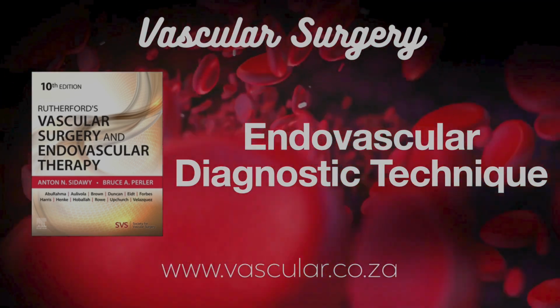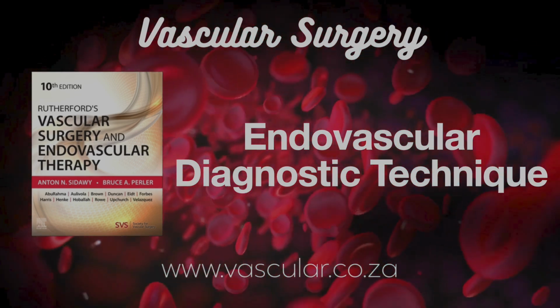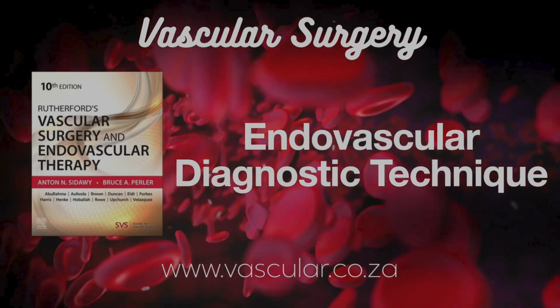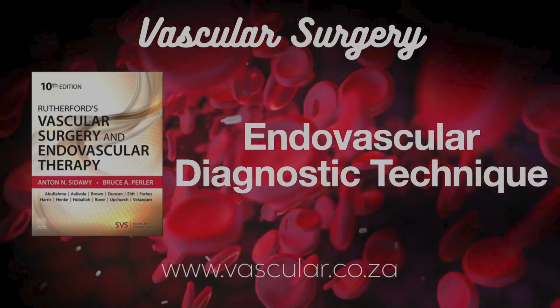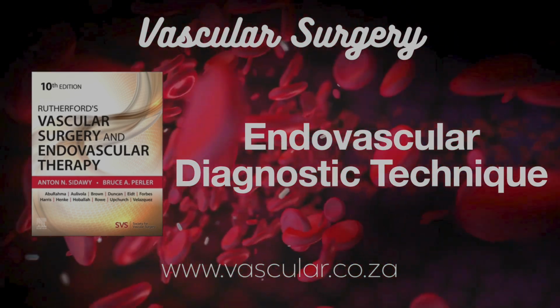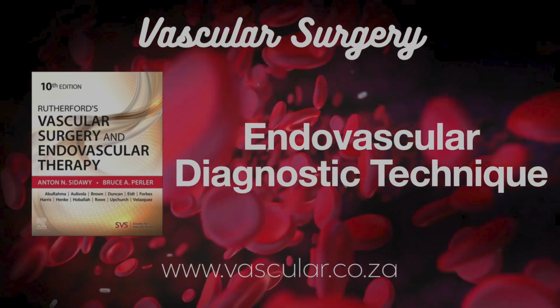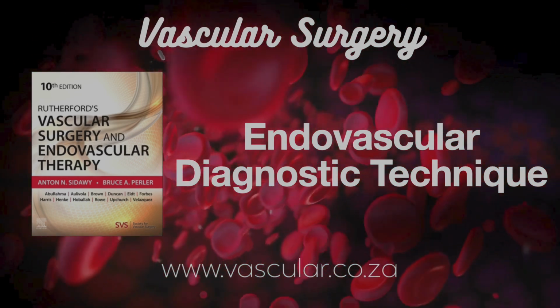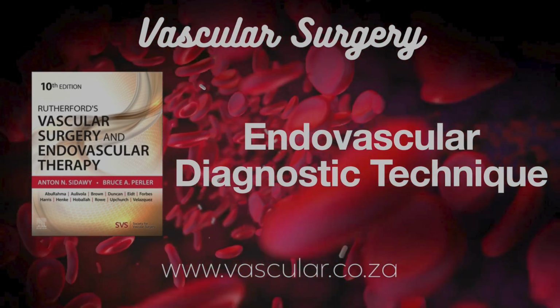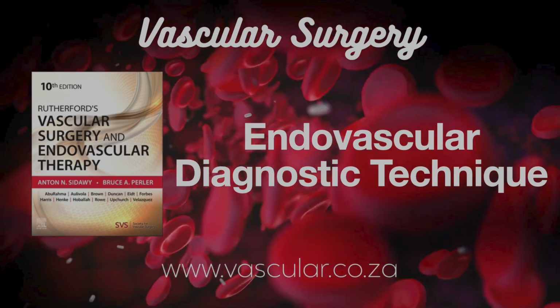Now, you said the puncture location is critical. Getting it wrong can cause problems. Oh, absolutely. Big problems. If you puncture too high, too cephalad, we say, like above or through the inguinal ligament, you risk hitting the external iliac artery. And that's bad because you can cause a retroperitoneal hematoma, bleeding behind the abdominal lining. That can be really serious, very hard to control with pressure. Yikes. Okay. And too low?